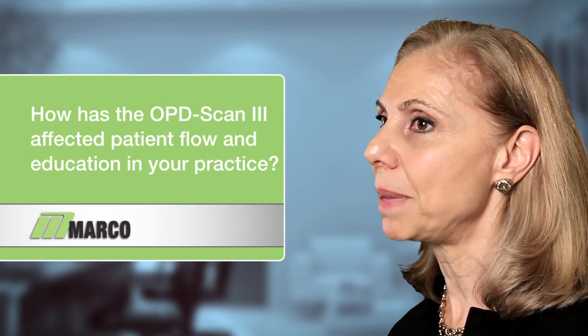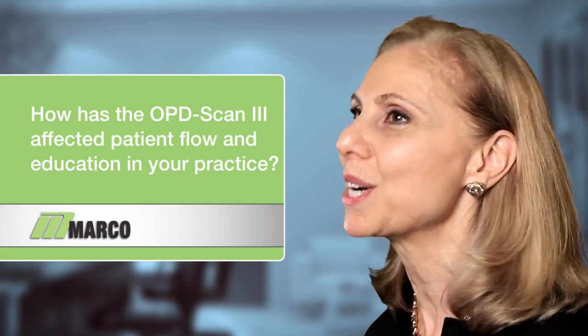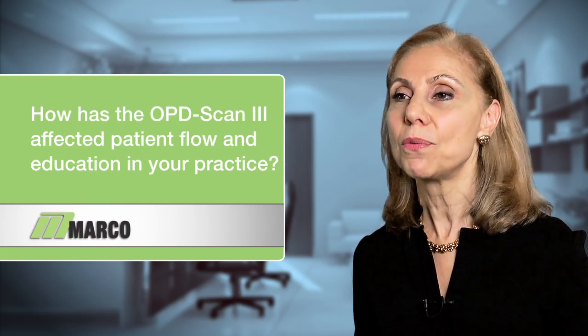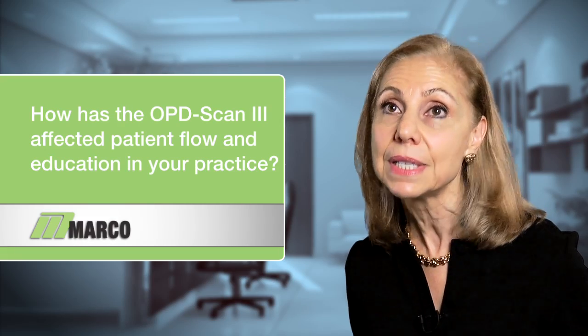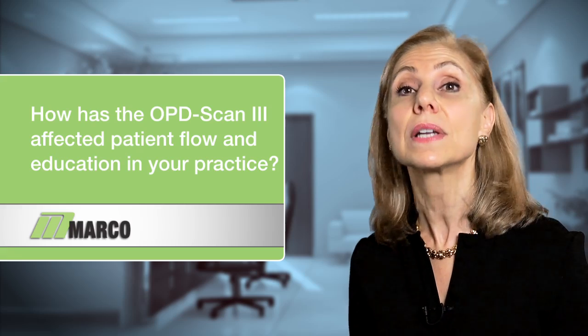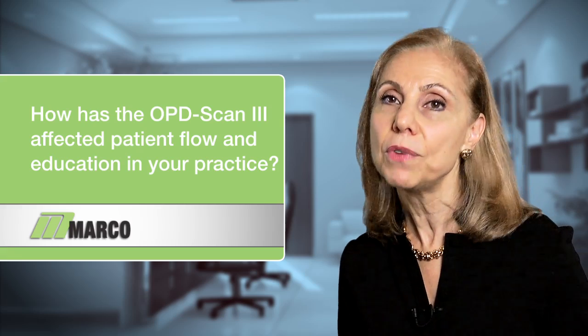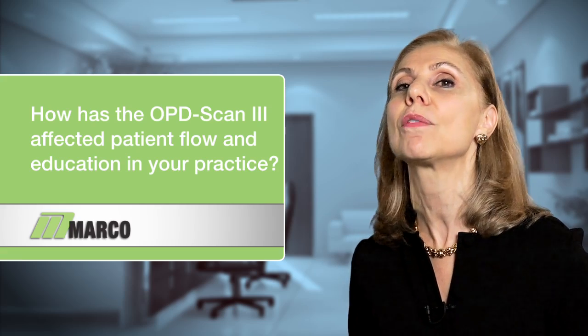This really helps the patient finally understand what this nebulous word astigmatism is to a lay person. Moreover, the family members get it too because they're seeing the bow tie, they're seeing the astigmatism, or they're seeing their positive angle kappa, where the visual center is way off from the anatomical center of the pupil.